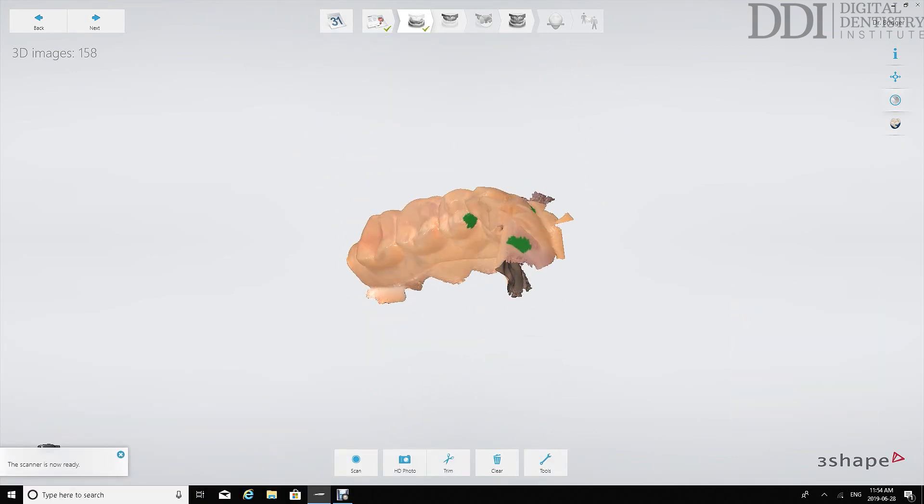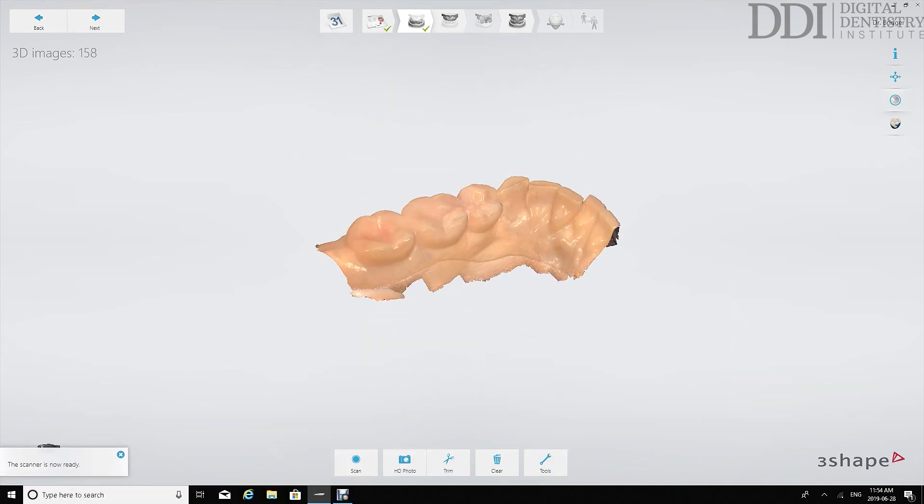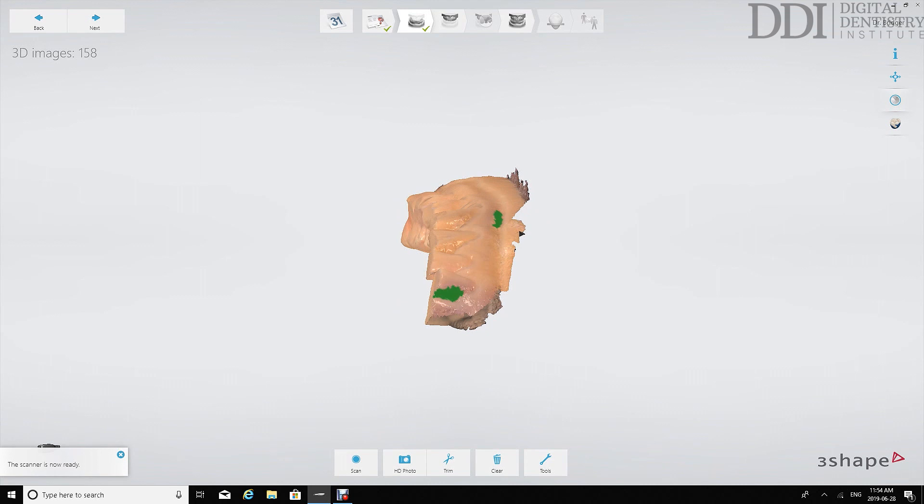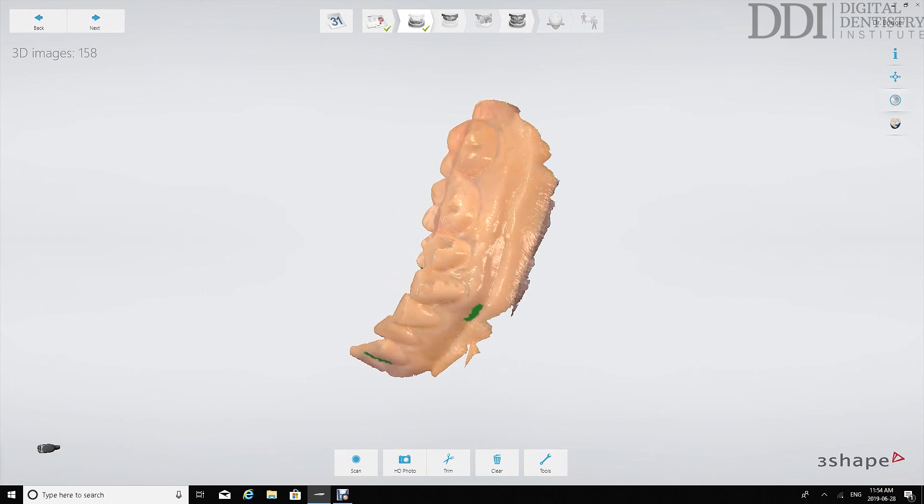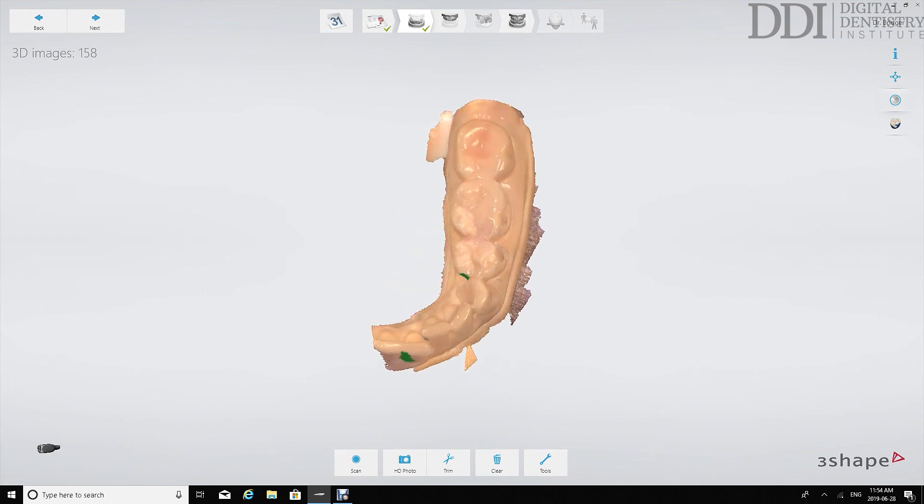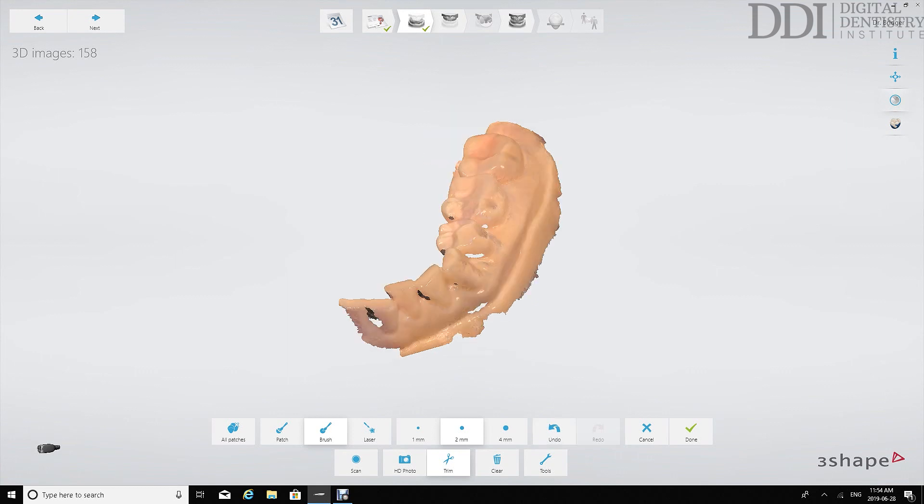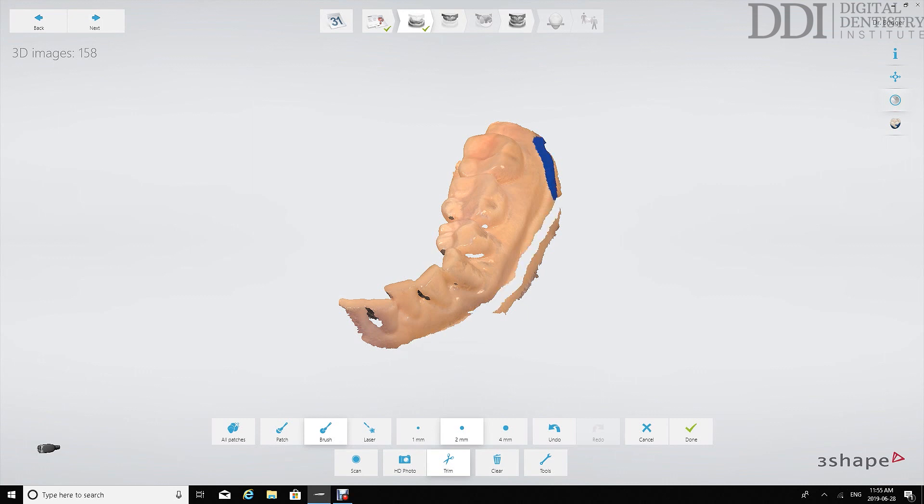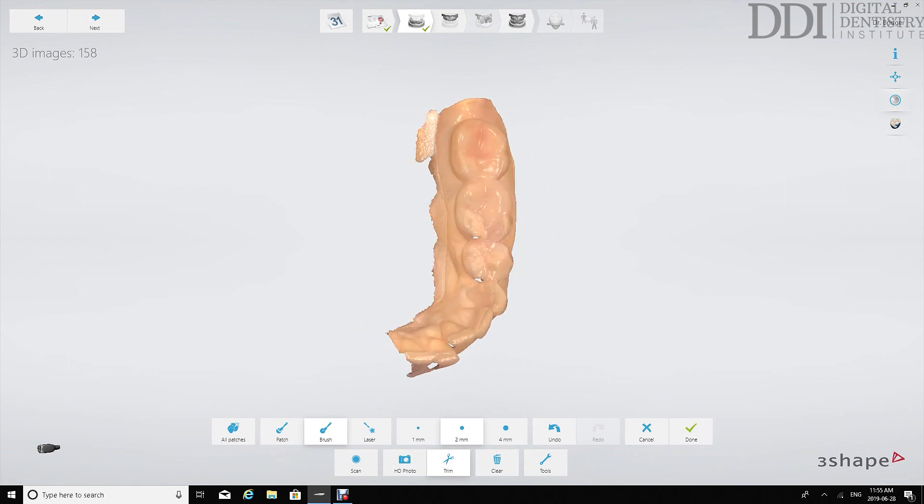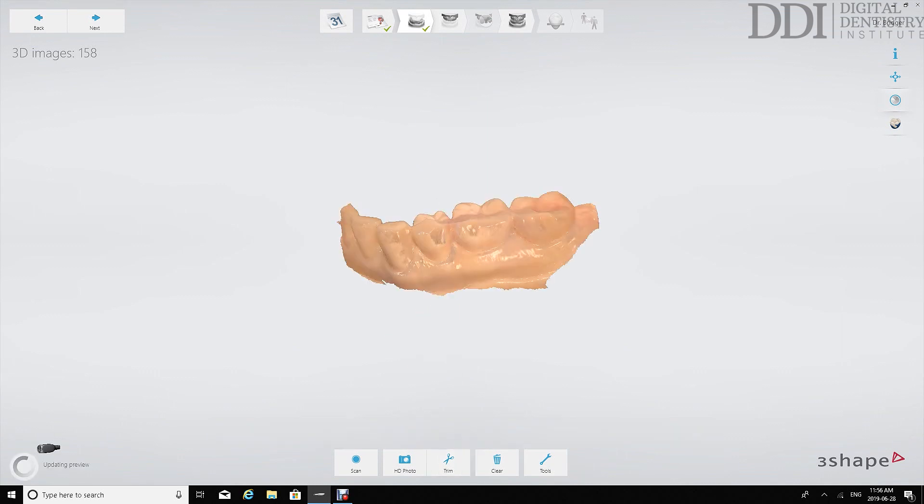What we see here is the completed scan of the opposing quadrant. At this stage we're able to utilize the trim tool to get rid of any areas or soft tissue that is not very useful. What this does is it reduces the chance of it interfering when we take our bite scan but also trims the file down so that when you're sending it to the lab it's more compact and easier to use.